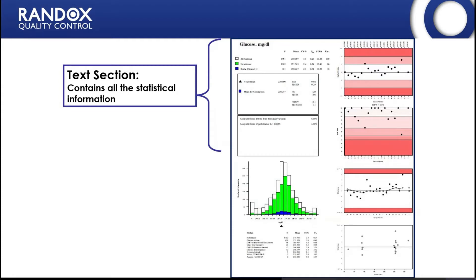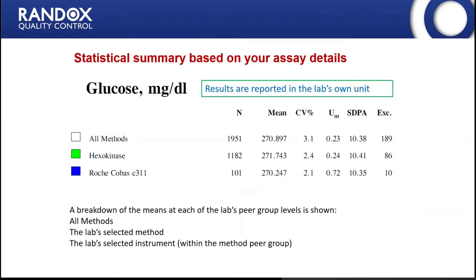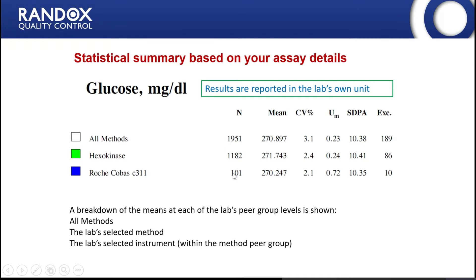The first section is the text section, which contains all the statistical information. At the very top we have the analyte name and the lab's chosen unit — labs can all report results in their own units; we do all the conversions for them. Underneath this you can see the breakdown of the different peer group comparisons. We have 'all methods' indicated by the white box, the methods the laboratory has chosen indicated by the green box, and the instruments within that method group indicated by the blue box.